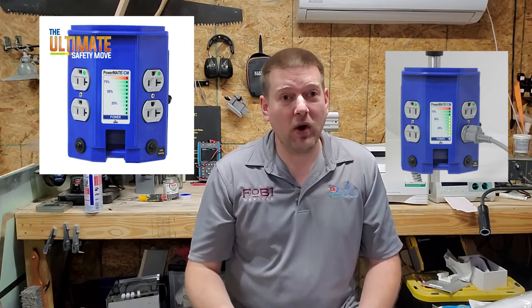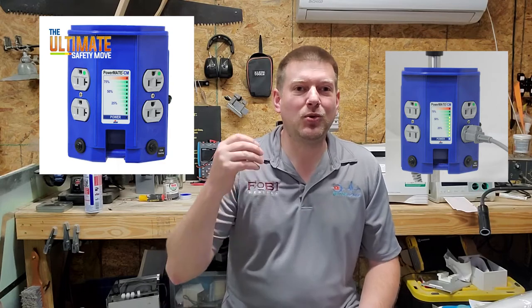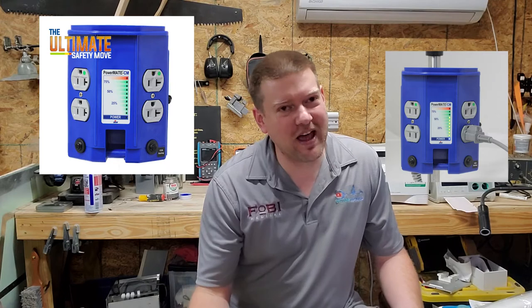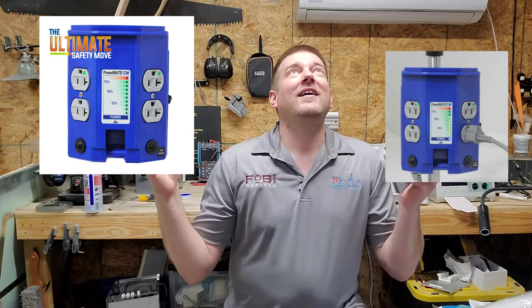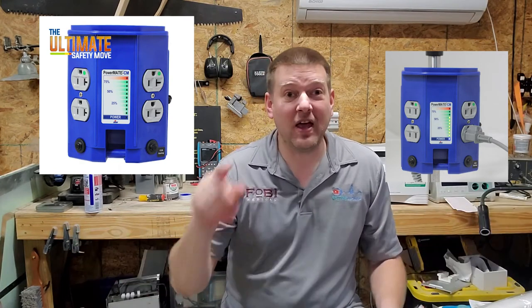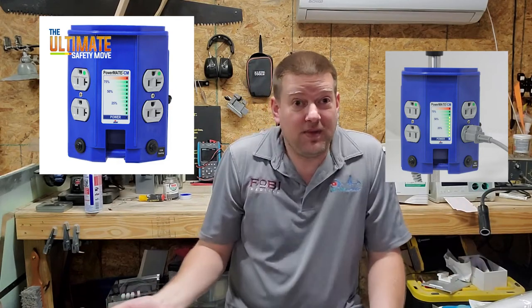So now we've got the 20-amp Hubble outlets installed. It's got the heavy 20-amp power cord that goes to the wall. And the number one feature that I super love is the visual graphical representation of how much current is being drawn by the power tap. That is awesome because now the staff knows when they're overloading something. This is the number one problem with power taps in all of hospitals, especially in operating rooms. Guys, we can't shut down an operating room to completely revamp the electrical. So what they do, they run power taps.